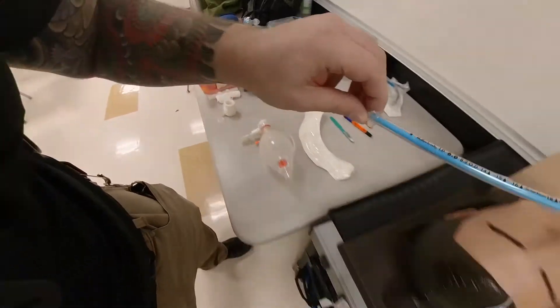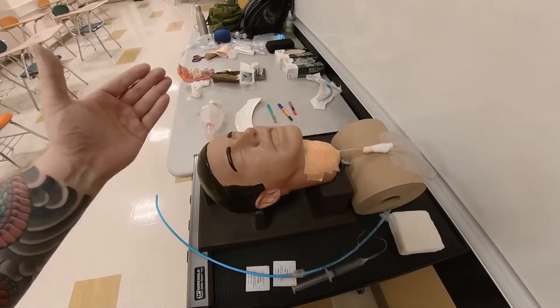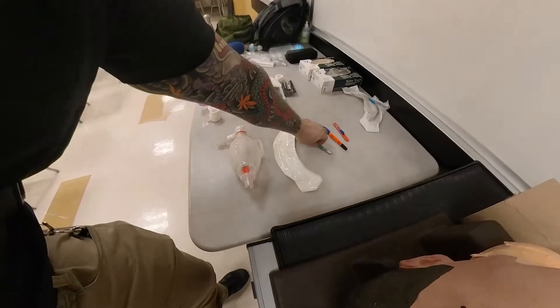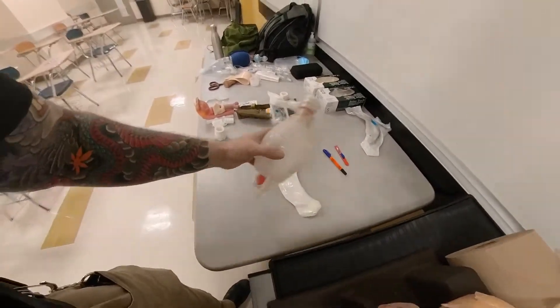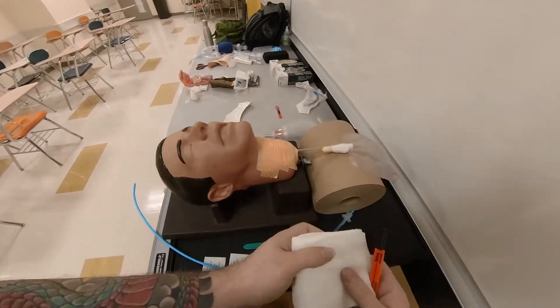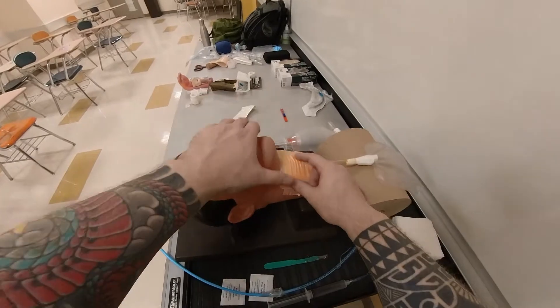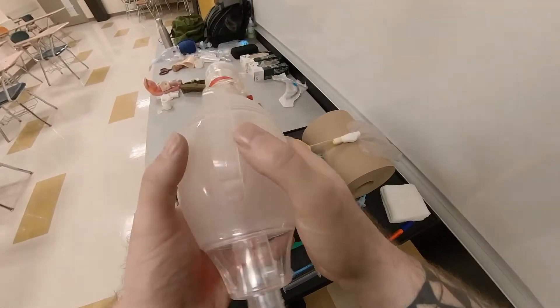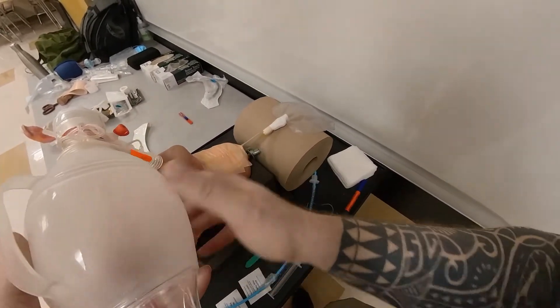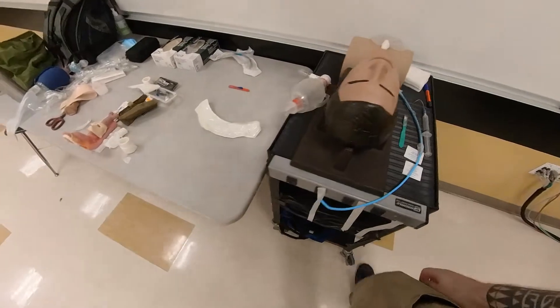Place all your equipment nearby so it's easy to reach. You want to be on the patient's right side if you're right-hand dominant — get all your equipment near you: scalpel, BVM, marker. You'll also need 4x4 gauze because this will bleed profusely. You also want to wear a head covering and eye protection, because if someone is managing the airway from the other side and squeezing the bag while you're making your incision, the moment you make the incision and they squeeze the bag, you will have blood splashing in your face. Wear face protection, eye protection, and a face mask.